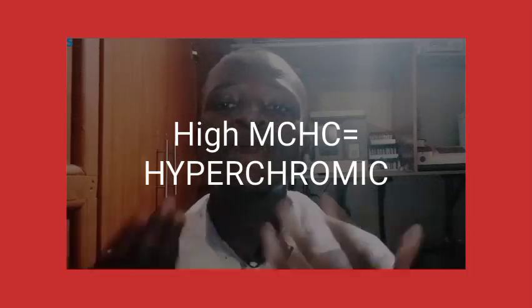And also when MCHC is high, maybe you can guess that if we have normal and we have hypo, when it is high it will be, yes, hyperchromic. So a hyperchromic condition is a condition whereby the MCHC is higher than the required amount, which is 32 to 36 grams per deciliter.